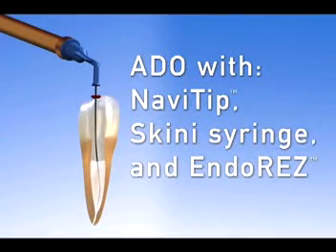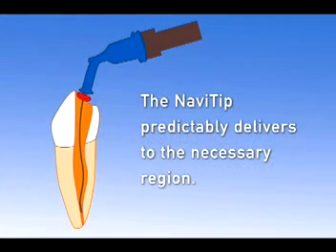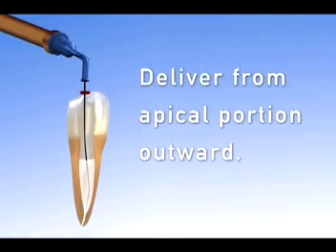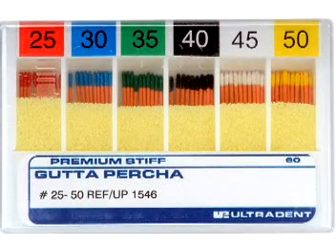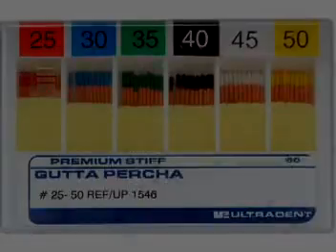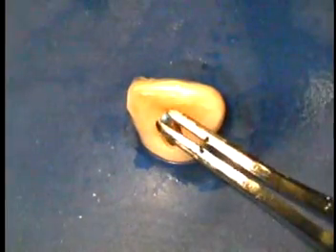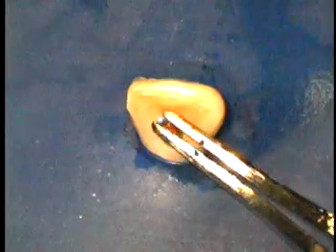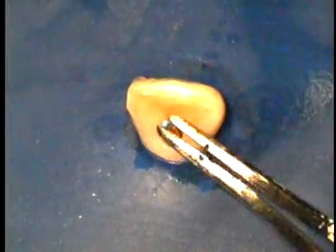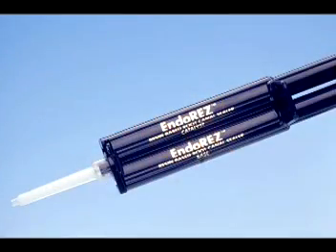Obturation was achieved using Navi tips, skinny syringes, and EndoRes. EndoRes is a urethane dimethacrylate resin-based material. It's hydrophilic, it's biocompatible, and it's very radio-opaque. We use this with a single gutta-percha point. The master gutta-percha point matching the last file used is fit. These are premium stiff gutta-percha, they will not noodle on the way down the canal.